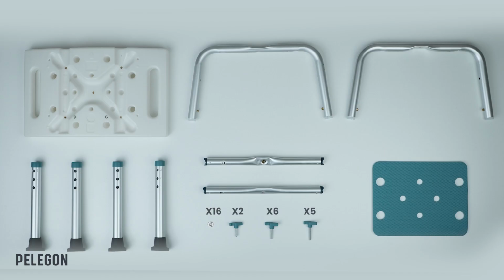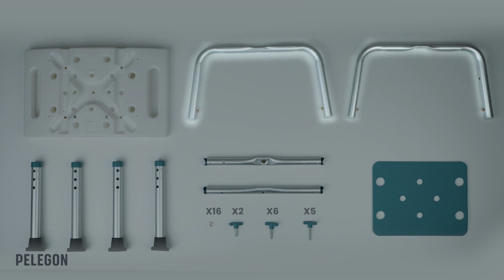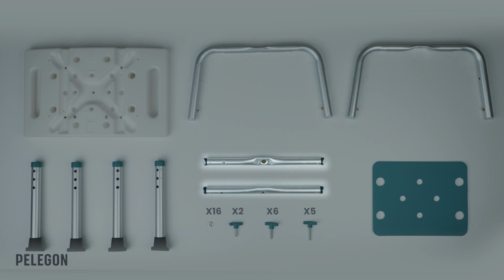Let's display all the different parts in front of us. First, notice the seat, which has stickers on it. Next, the two U-shaped bars, also with two stickers B and C. Next, there are two straight rods with curved tips on both ends, labeled D and E. And here are 4 legs with rubber tips and a seat pad.